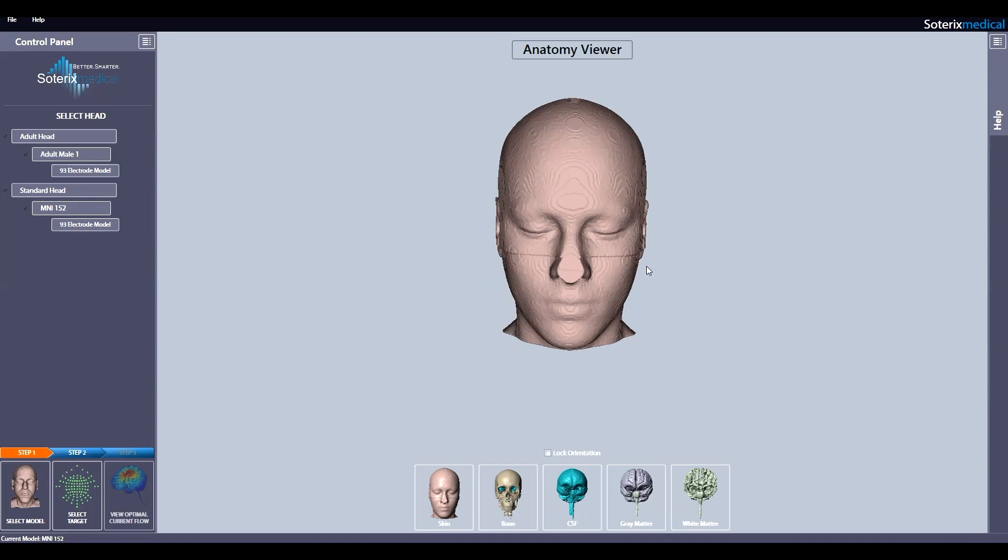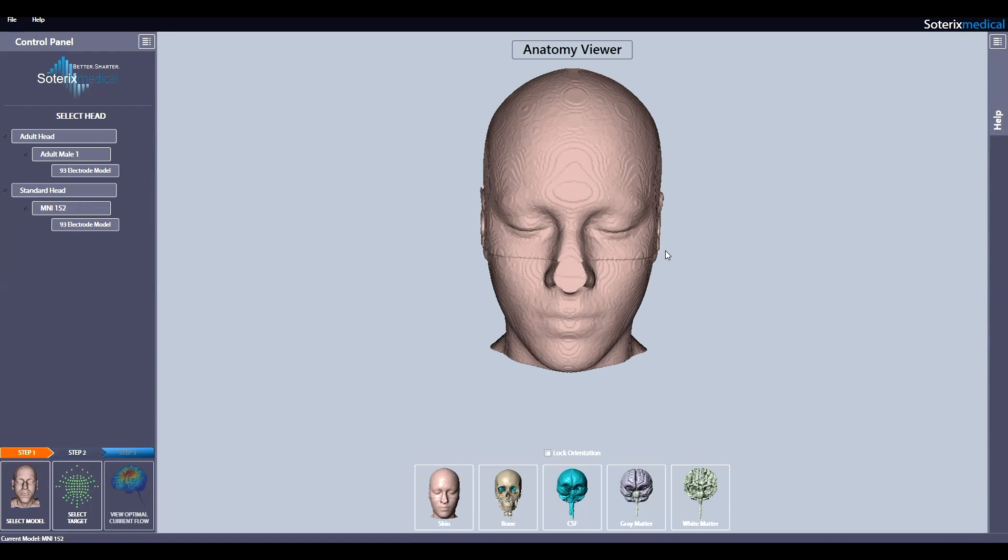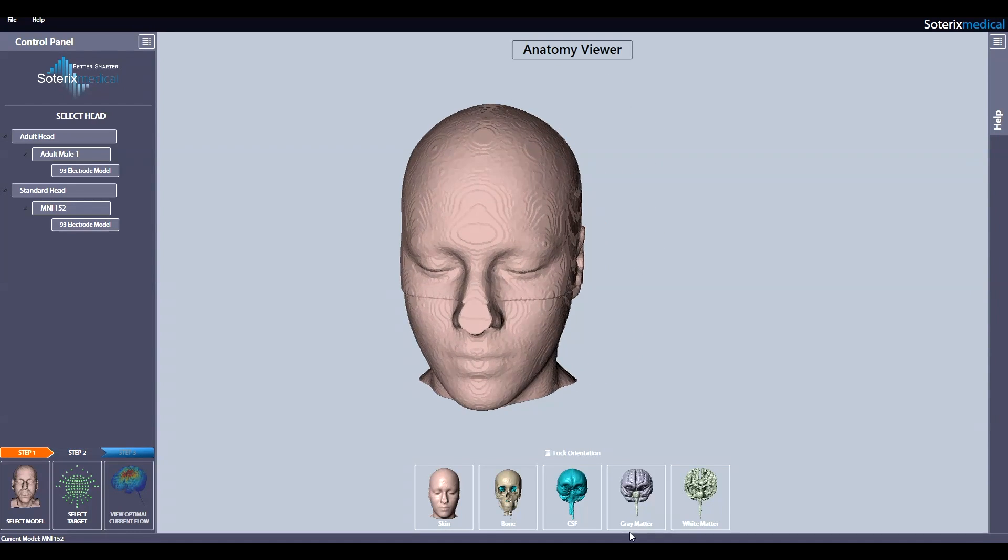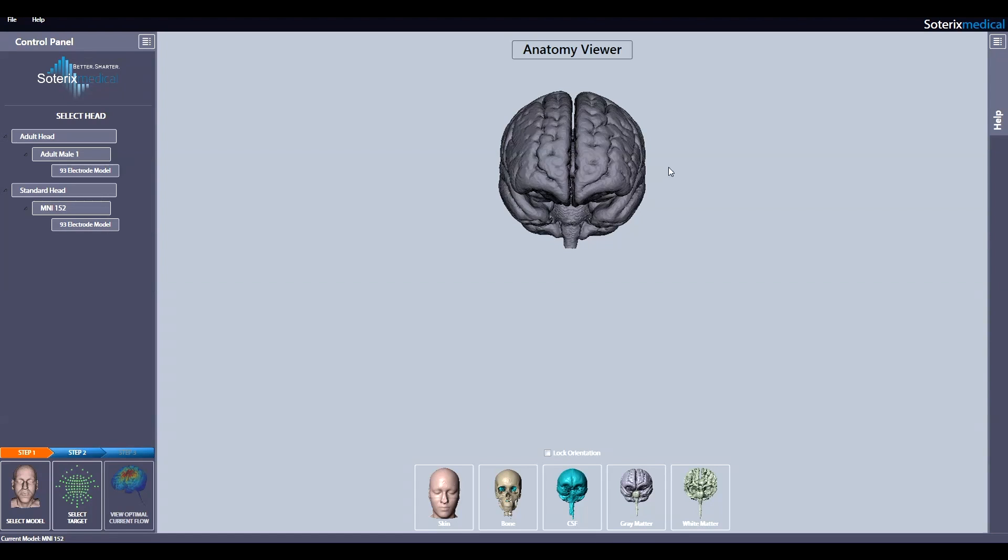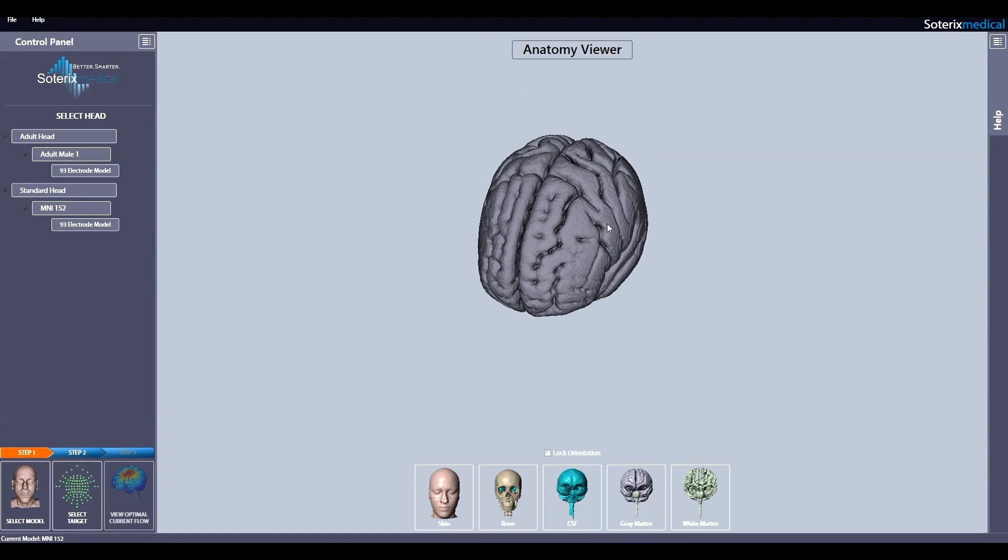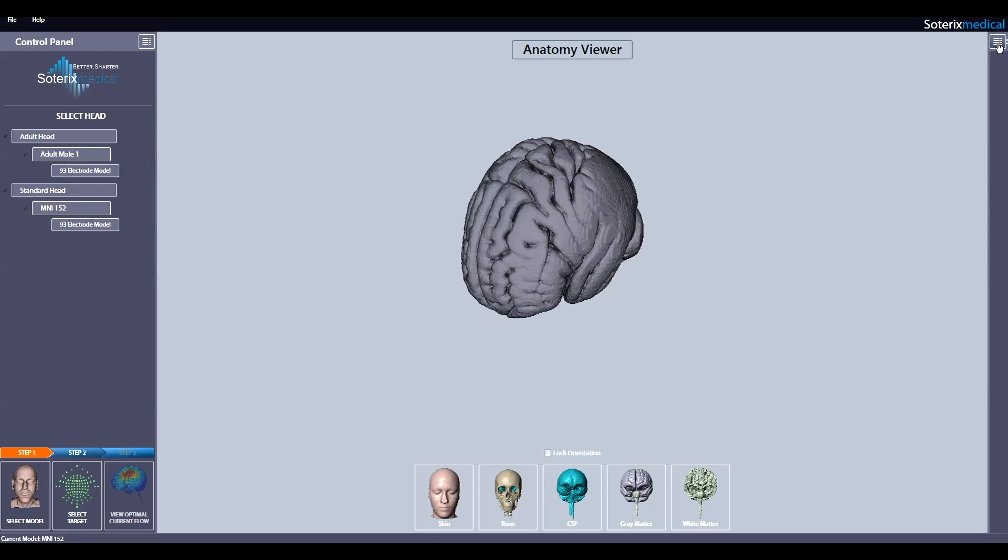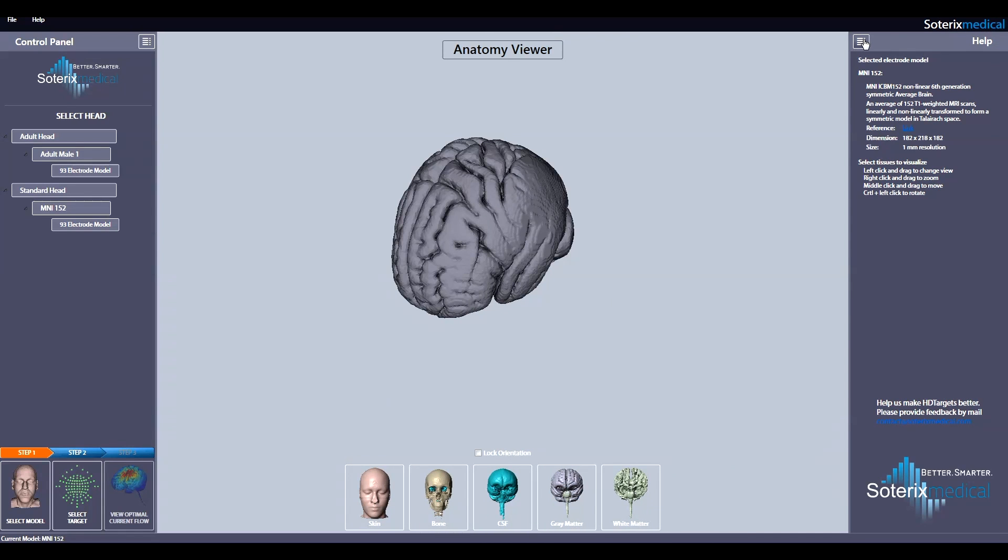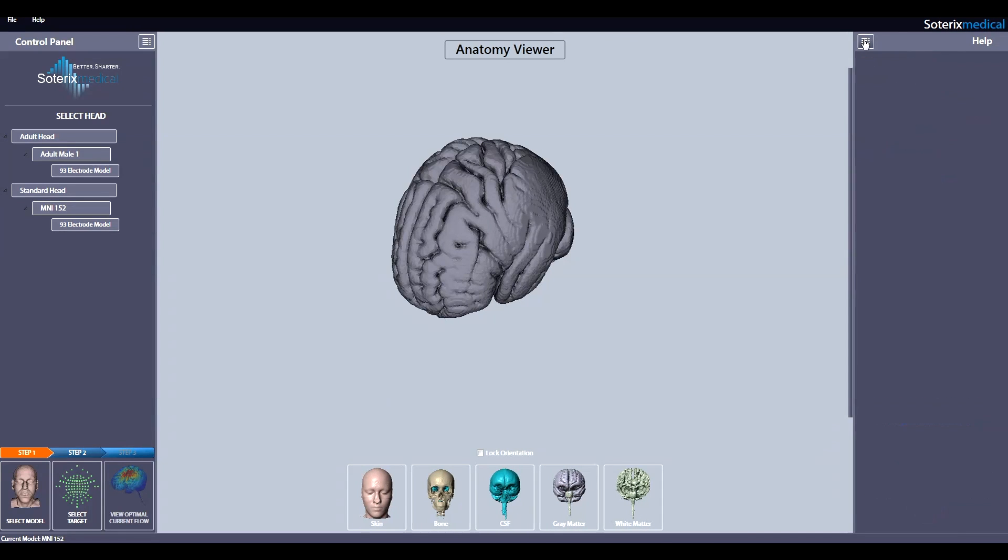You can zoom, move, change, and rotate views using the keyboard and the mouse. See the Help Section on the right for specific instructions.